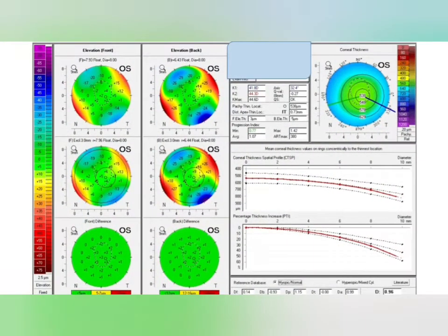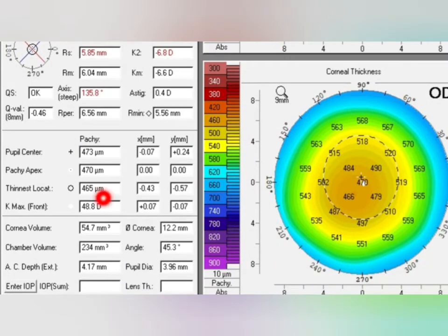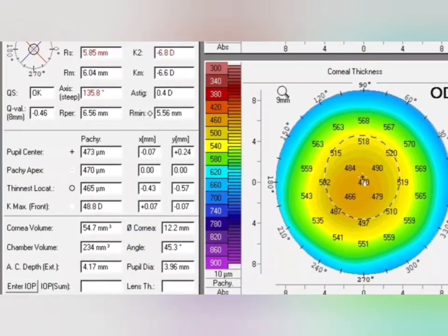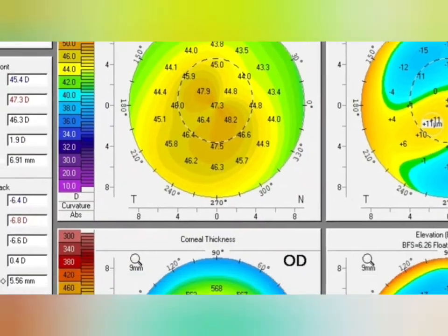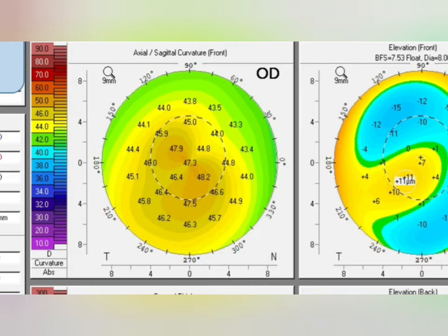Now let's move to the next case. QS value is absolutely normal and Q value is also normal. The Kmx value is 48.08 — it should be less than 47.20, so this is a suspected case. The thinnest local is 465, where it should be more than 470, indicating some abnormality. The Y-axis deviation is more than 0.5, also indicating an abnormal finding. The anterior sagittal map shows asymmetrical bow tie with inferior steepening; the difference between corresponding points is not more than 2.5, but other parameters are raising suspicion.